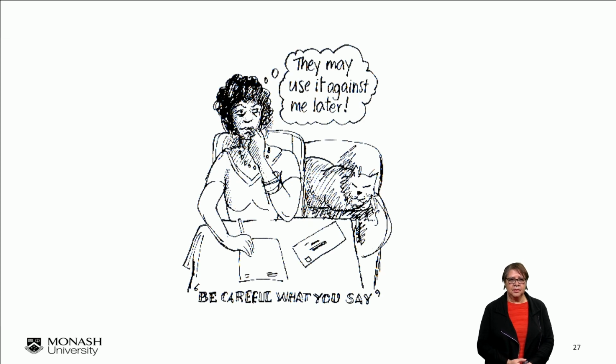So finally, be careful what you say. If you are unsure, consult with someone else or go directly to a radiologist, because remember, sometimes this can lead to litigation, and that is not what we want. We hope that with this unit we will assist you in making more informed opinions and to be more accurate in identifying and interpreting abnormalities or excluding abnormalities and identifying the normal appearances correctly.